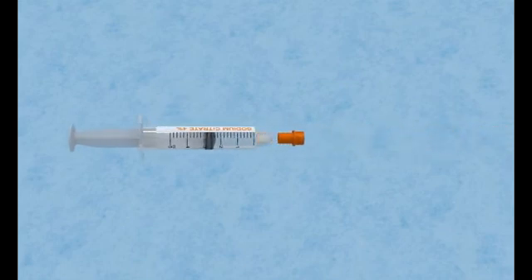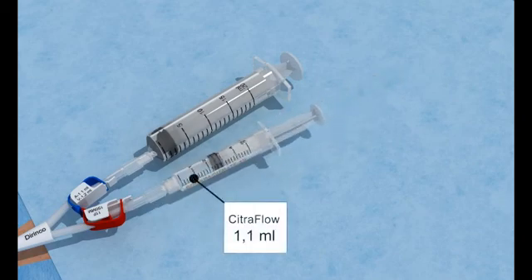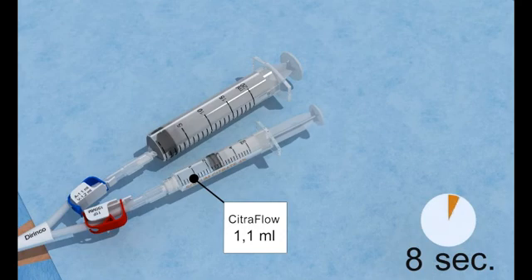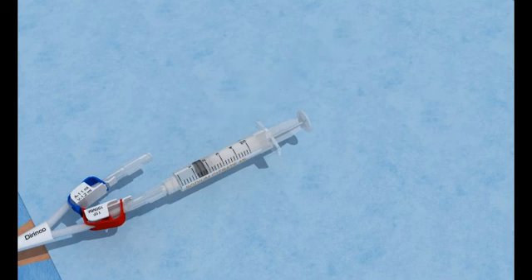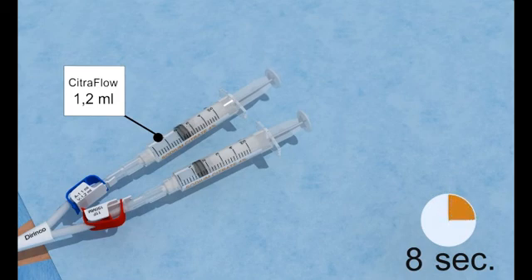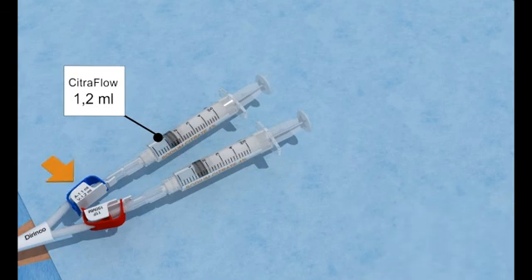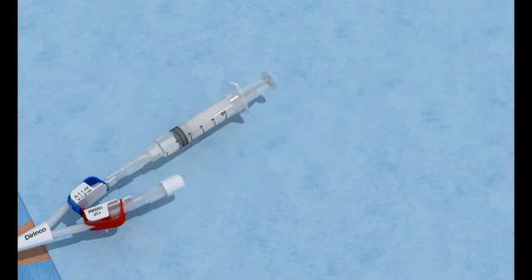Instill the Citroflow. Remove the empty 20ml syringe from the arterial port and put the Citroflow syringe on the arterial port. Instill the Citroflow slowly, over 8 seconds, in the arterial lumen. Repeat the same procedure for the venous lumen. Remove the syringes and close the lumens with sterile caps.